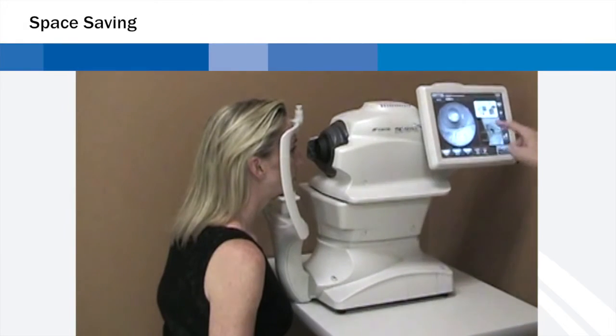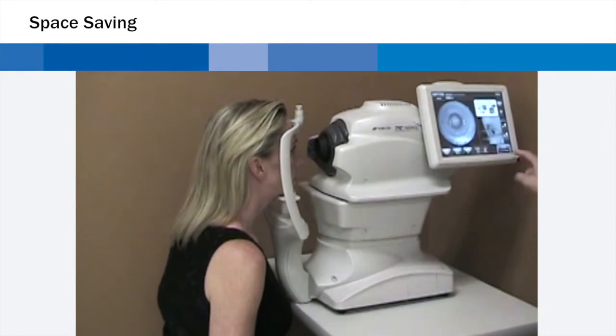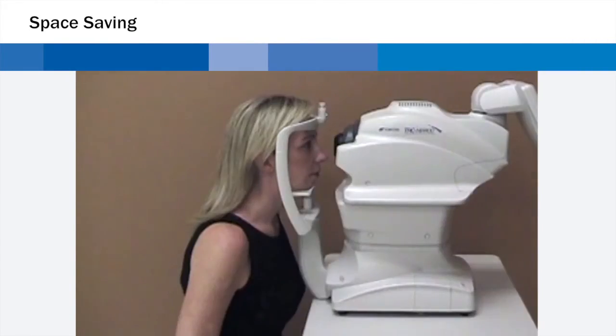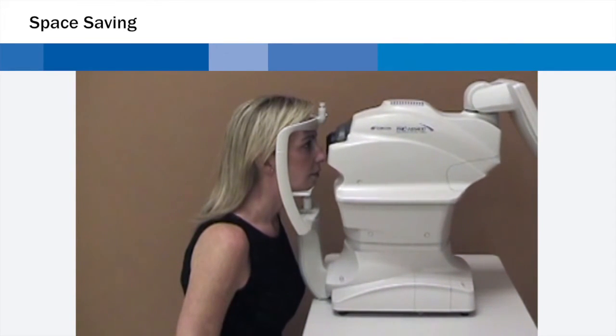The Topcon TRC-NW400 offers a perfect solution in a limited space. With a rotating touch panel monitor that allows operation of the instrument from virtually any angle, the photographer can be in front, behind, or at either side of the patient, optimizing space saving.